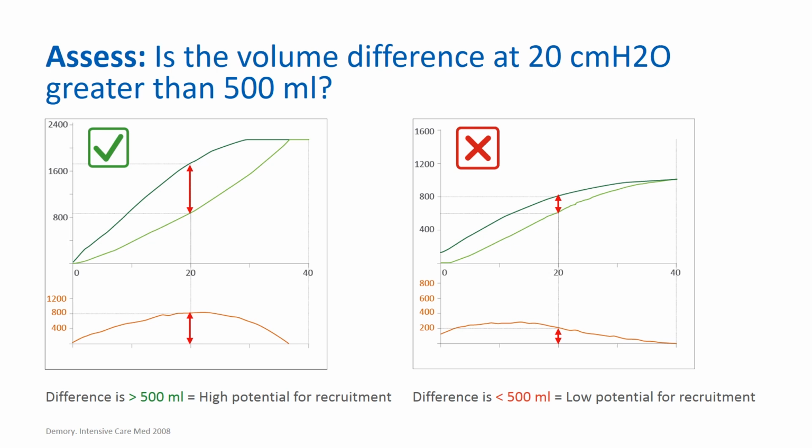To view this difference, touch the PV Tool graphics panel and select the pressure over volume plus pressure over delta volume, or DV, graph option. Following this, you will select cursor 1 and turn the PNT knob to the right until the cursors are set at 20 centimeters of water pressure on the x-axis. From here, you can directly measure the difference in volume using the plot below the curve or the direct measurement on the right side of the screen. I will provide you examples in the subsequent slides.